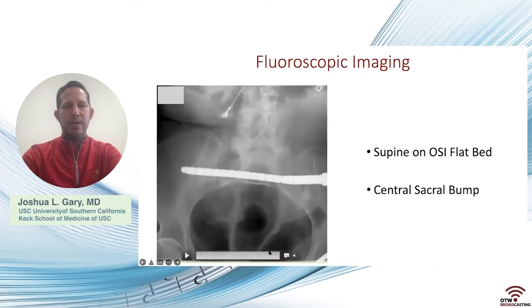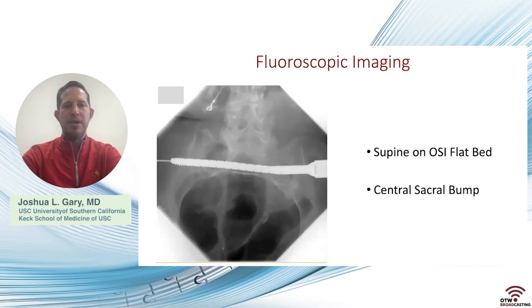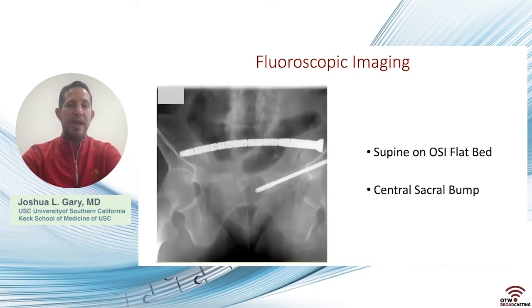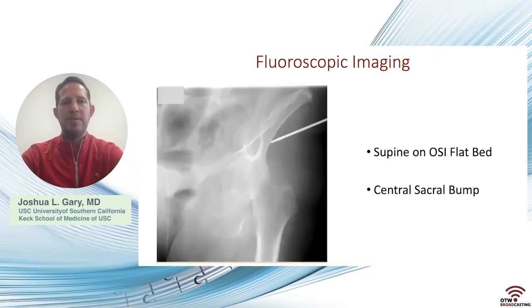So you can see on these final images with fluoro here, and we'll go over the CTs in a second, you can see that now in this dysmorphic segment at S1 above a transverse component, you can see an outlet image here where we've been able to safely go across that corridor. And you can see an inlet image here. And so, I think this was a real advantage and something I couldn't have done before the CurvaFix. And I think you may have been just trying 2 SI style screws in the upper sacral segment. And then if you had issues, you're looking at lumbopelvic fixation. But I think this was a really nice solution for a problem we couldn't deal with percutaneously before.